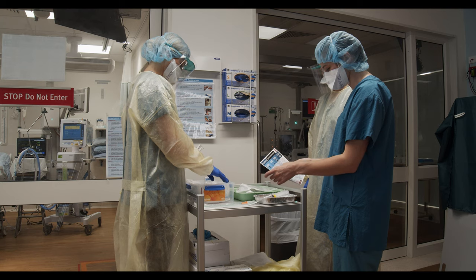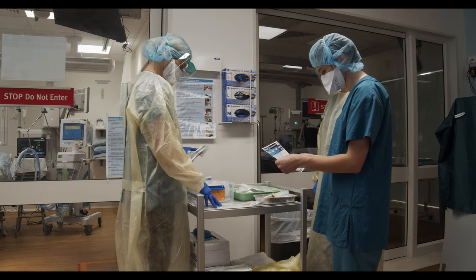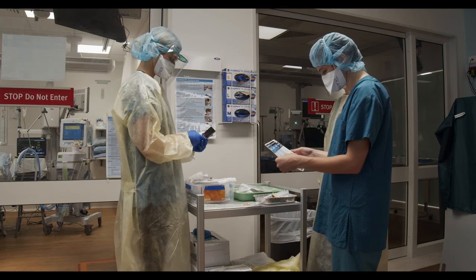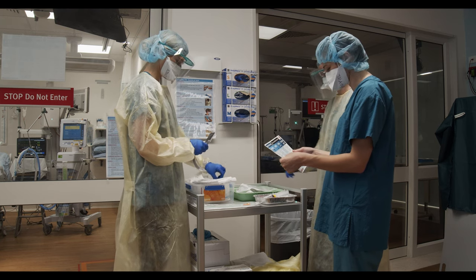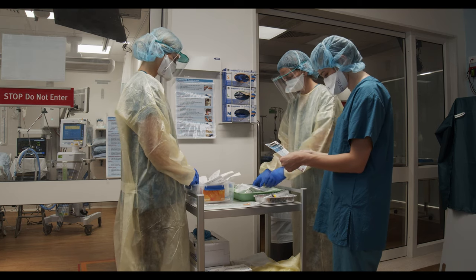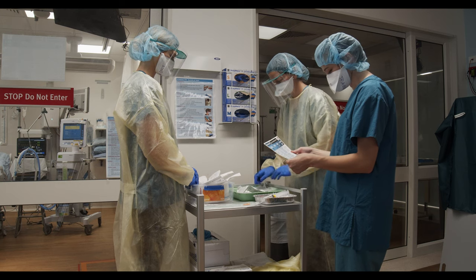For our intubation scenario, we have an experienced intubator, a second doctor administering the drugs and managing physiology, an experienced nurse who will become the airway and ventilation assistant. The bedside nurse and airway assistant is likely to be inside the room already with the patient, whilst the runner can go through the checklist with the team outside. During the checklist procedure, it's important to run through your airway equipment and adjust any sizes.